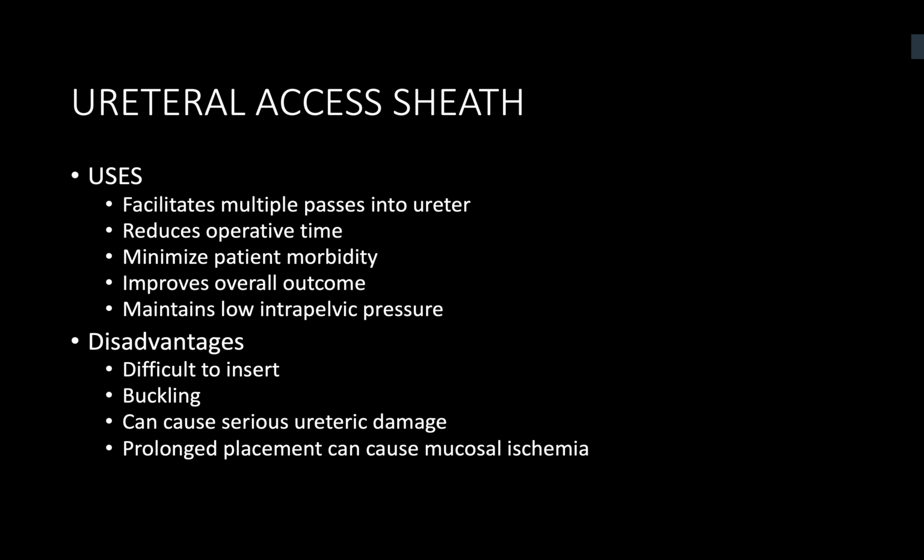Do you normally use a ureteral access sheath during the flexible ureteroscopy? So the choice as to whether an access sheath is used depends on different factors. If the patient has been pre-stented prior and the ureter is known to be dilated or had previous stone surgery on the ipsilateral side, then it is more likely to accommodate a ureteric access sheath. However, where there is a ureter which has not been operated on before, then it could be argued that using a sheath in this scenario has a greater risk of ureteric trauma and avulsion. And in my practice, I prefer not to use a ureteric access sheath in this particular scenario. Okay, that's a well-formed answer.